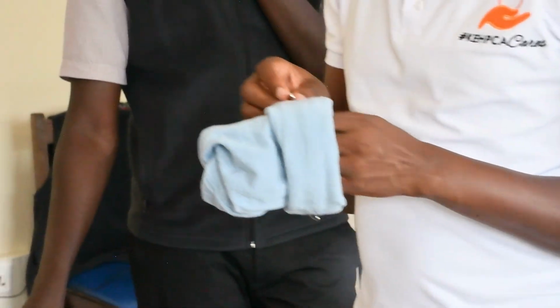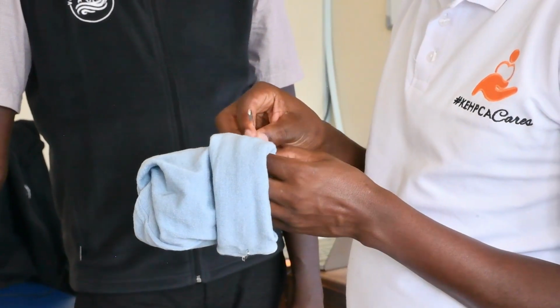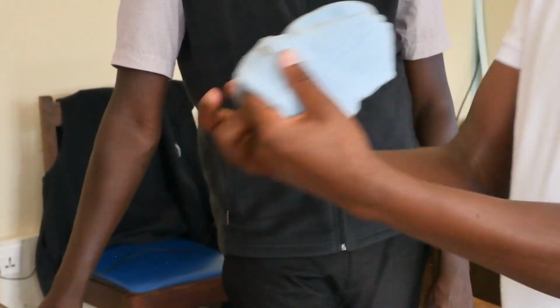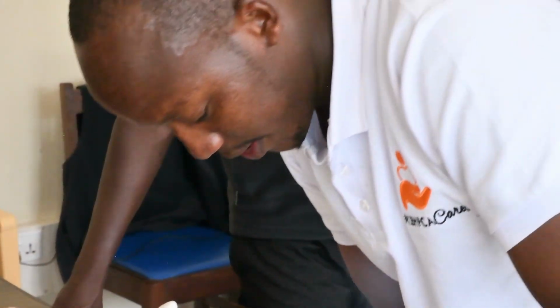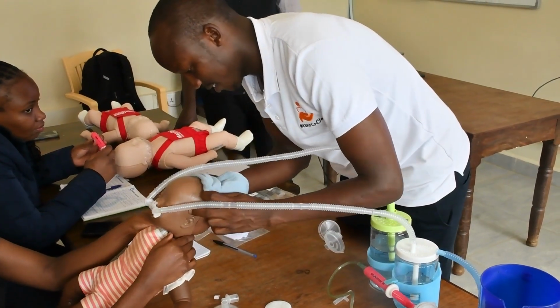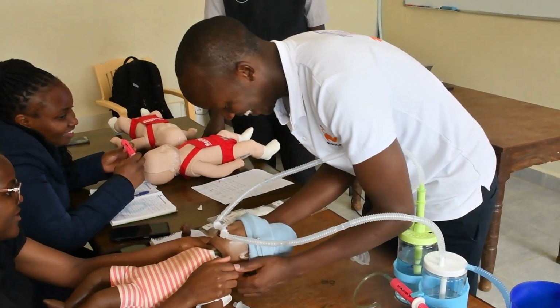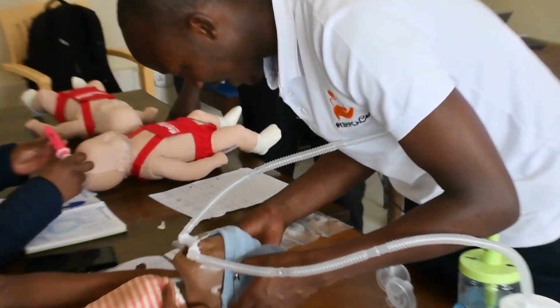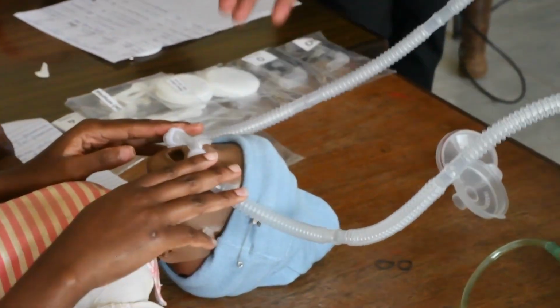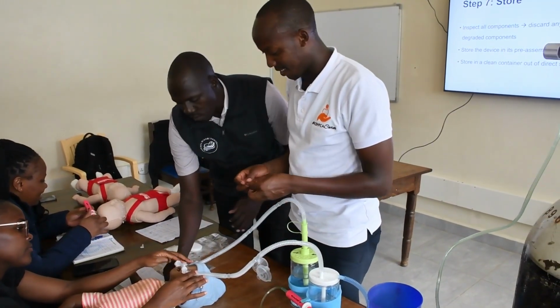We do it horizontally, only to our patient. We prevent this as much as possible. So you see, the pin is not exposed.